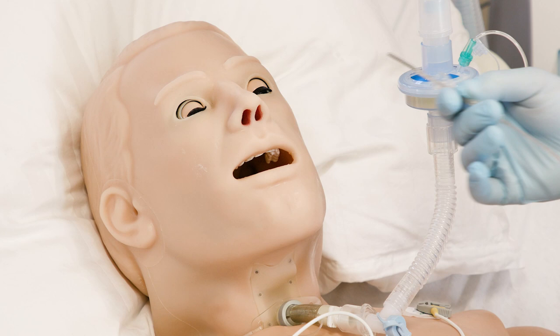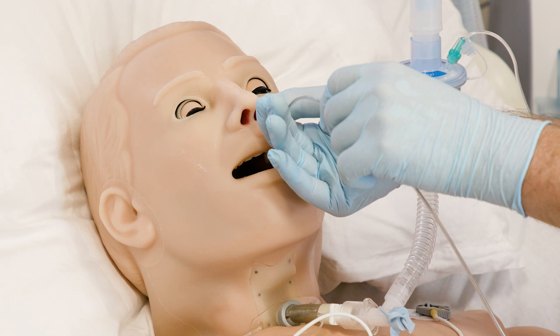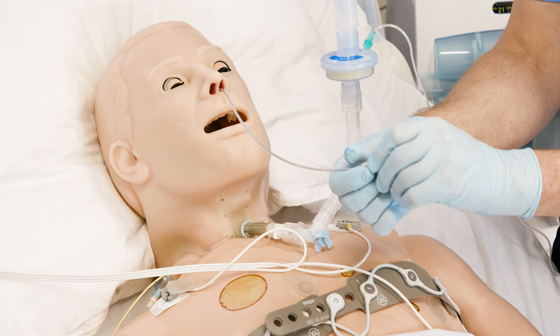Then, with the patient in semi-recumbent position and the head in straight position or slightly lifted forward, we slowly insert the catheter through the nostril and then through the hypopharynx with just a smooth advance. We advance the probe further to the stomach. Then we remove the guide wire carefully.